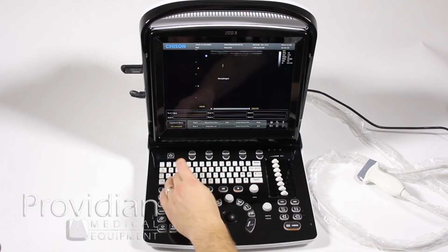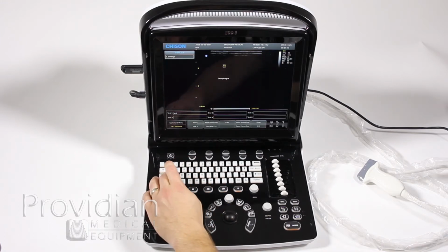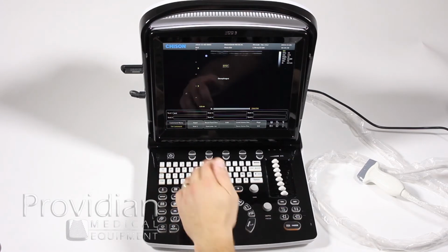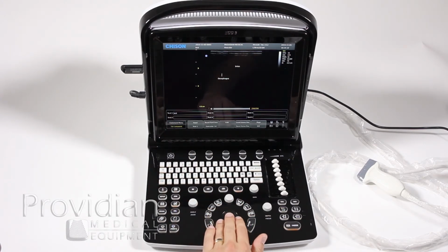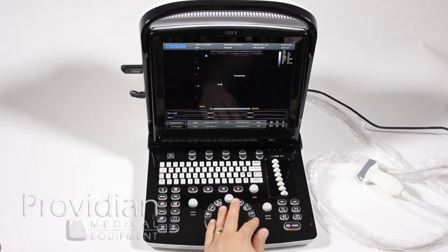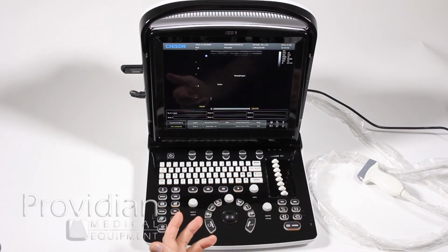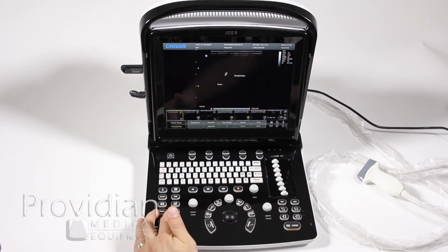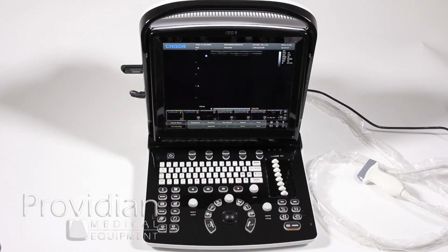If I don't want that library, I can just go ahead and type Brian, and place it on screen. Same thing as before. I can hover over it, click it, move it, and put it in a different position. Once I've clicked enter, it's going to turn white, obviously, as you've seen. And then it's saved. You can save that image. You can add an arrow to it. Set, move arrow. And then if I want to clear them all, I'm just going to hit the delete key.